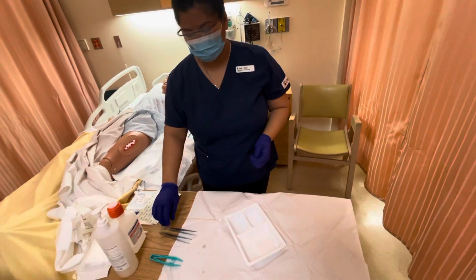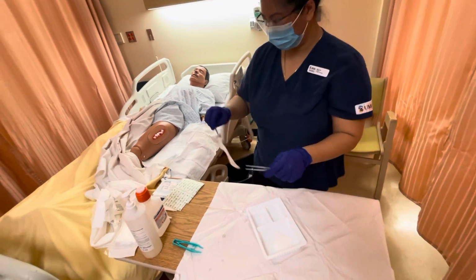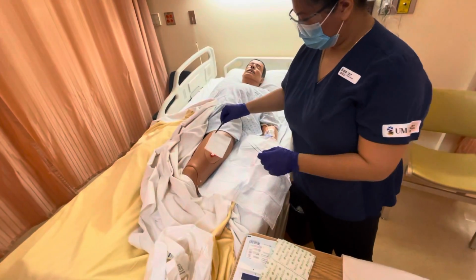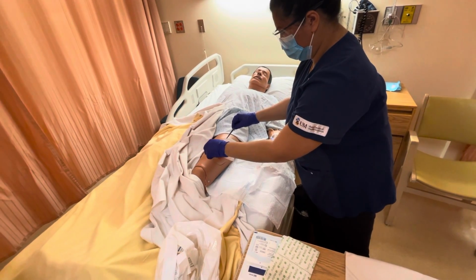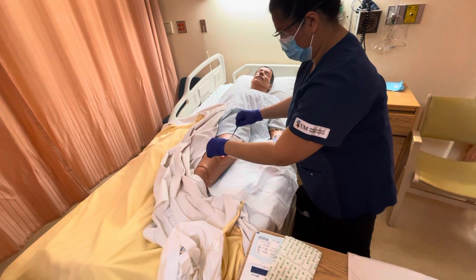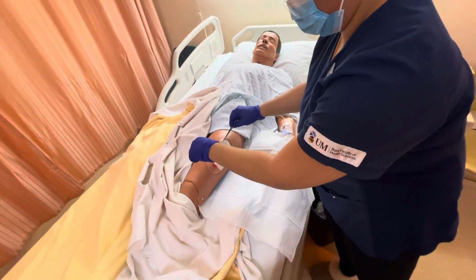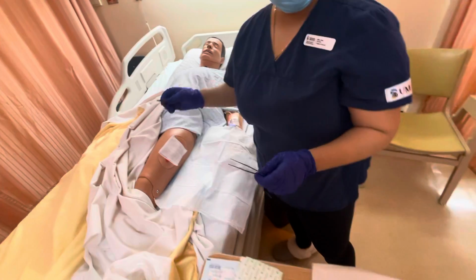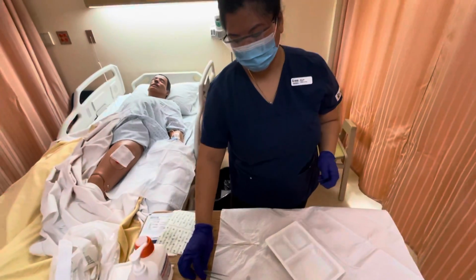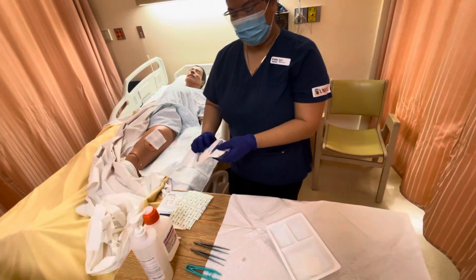And then we're going to cover the wound with another 4x4 gauze as per order. So our order stated just one 4x4 gauze. And then we can cover up the wound with an abdominal pad.